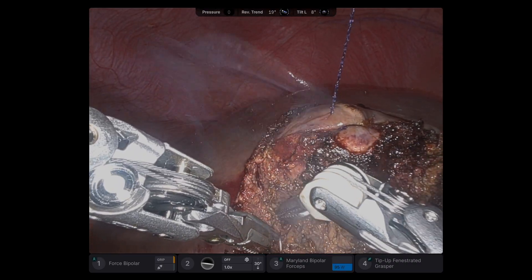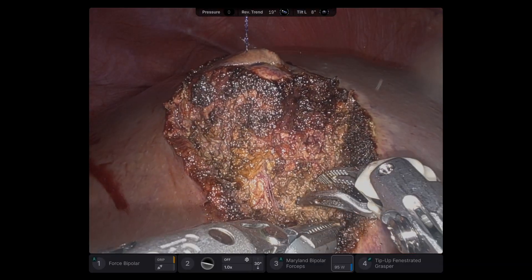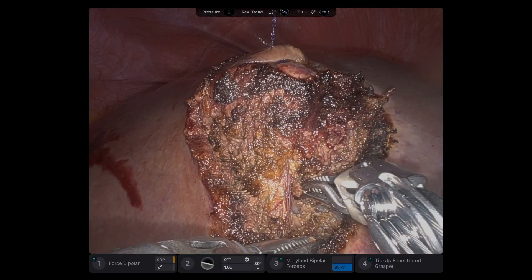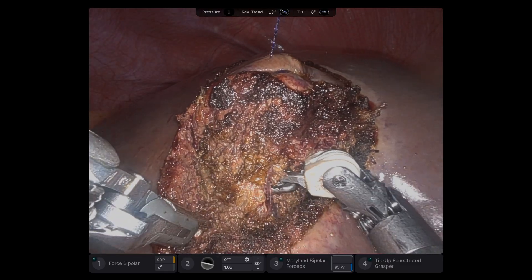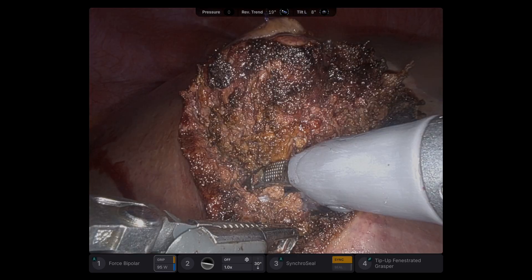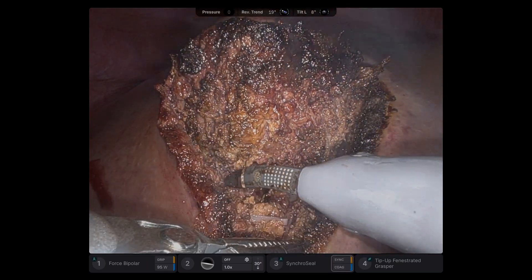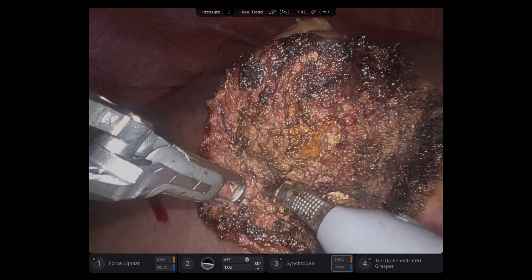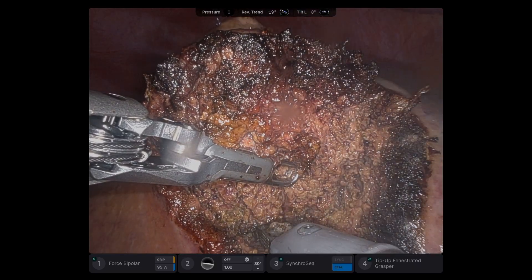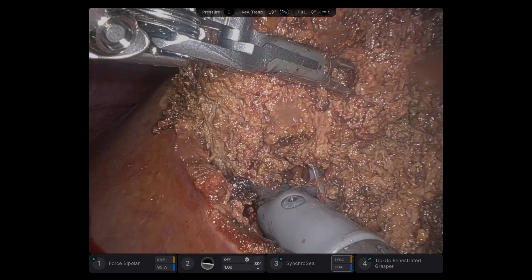This gives me the open book technique. I like fine dissection with the Maryland. This is the pedicle to this segment. The pedicle is clipped. There are some middle hepatic vein branches. The pedicle is really bloodless, and that V-Log was giving me very nice countertraction.